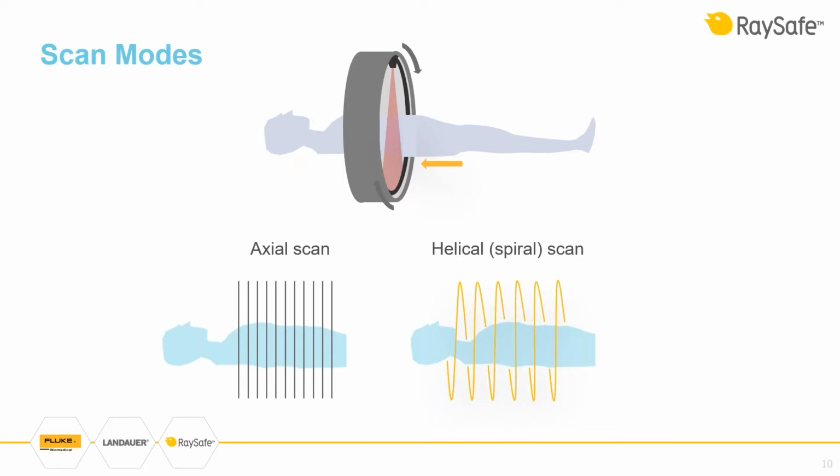And more sophisticated computer algorithms make it possible for the machine to create slices of the body. A continuous movement makes the experience a lot more pleasant for the patient compared to conventional CT. Since the total time for the investigation is lower, it reduces the risk of movement by the patient, and movement will decrease image quality.